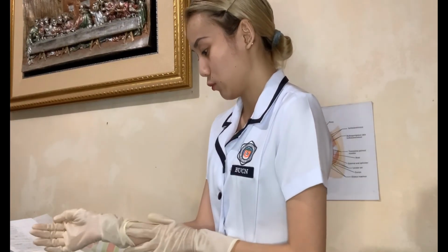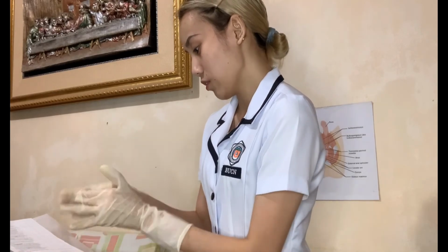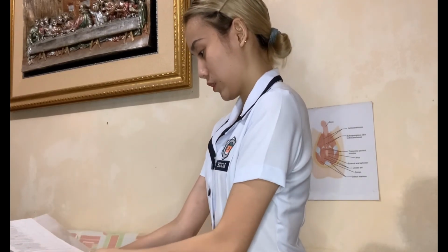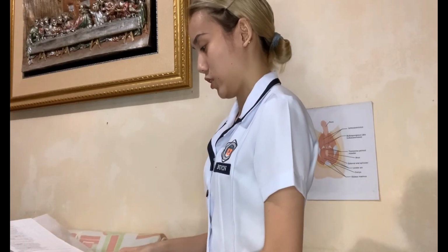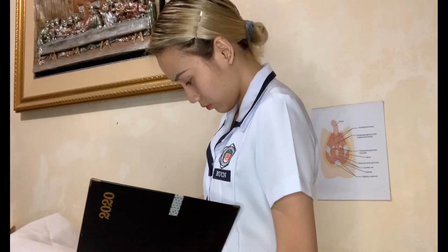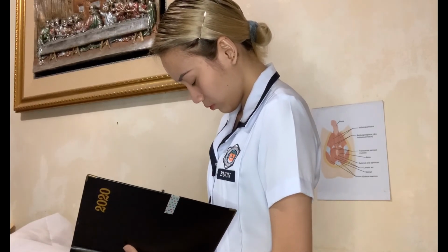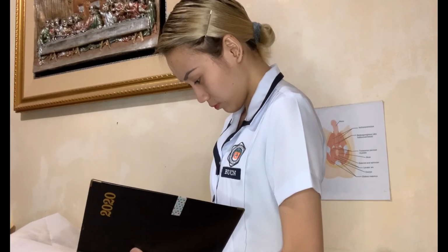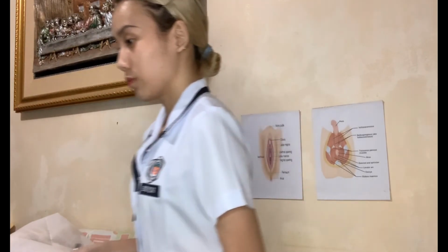We will now remove and discard gloves. And after that, perform hand hygiene. Lastly, document the catheterization procedure, including catheter size and results, in the client record using forms or checklists supplemented by narrative notes when appropriate.